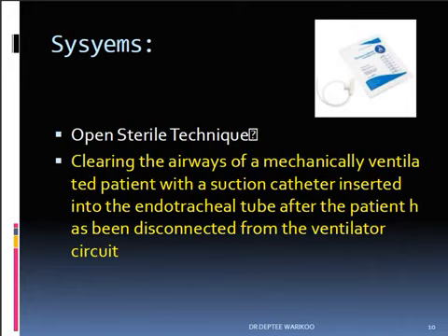Next is the open sterile technique. Here cleaning the airways of a mechanically ventilated patient is done with a suctioning catheter inserted into the endotracheal tube after the patient has been disconnected from the ventilator circuit.